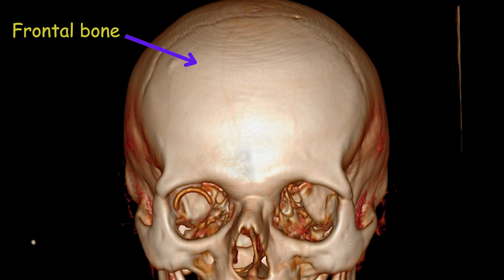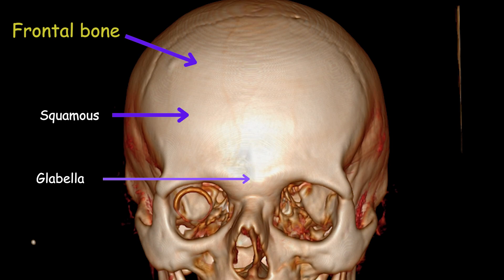The frontal bone consists of several distinct parts. The squamous part is the largest and most anterior portion of the frontal bone; it forms the forehead and the anterior part of the roof of the orbit. The glabella is a smooth, slightly depressed area situated between the eyebrows and above the nose, and plays a role in facial expressions, particularly those related to frowning or expressing concentration.